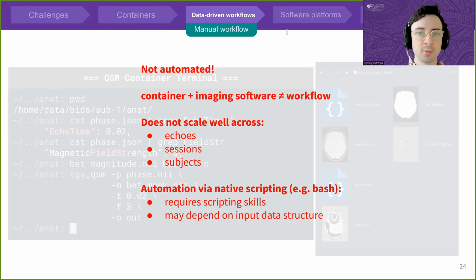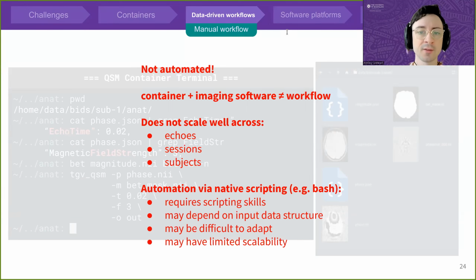It's time consuming, and it might change depending on the input data structure, which may make it also difficult to adapt. Also, without other tools, scripting won't make this scale very well to large data sets, and will make poor use of the system's resources.